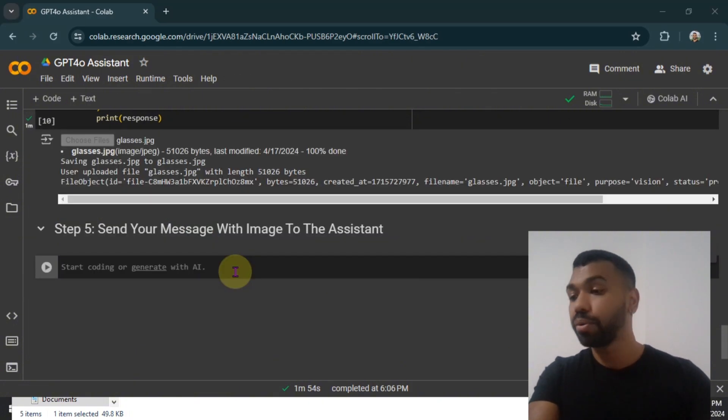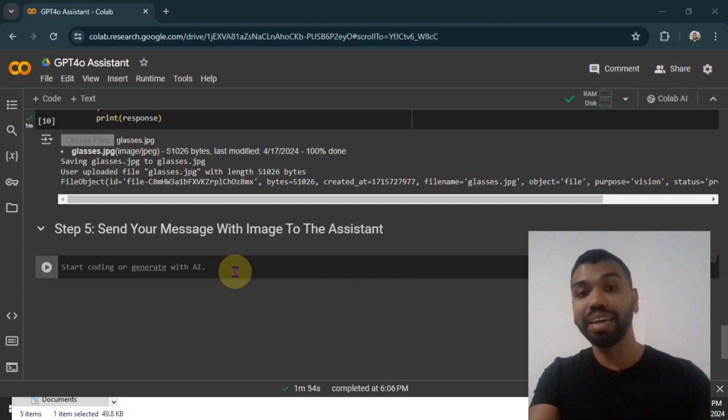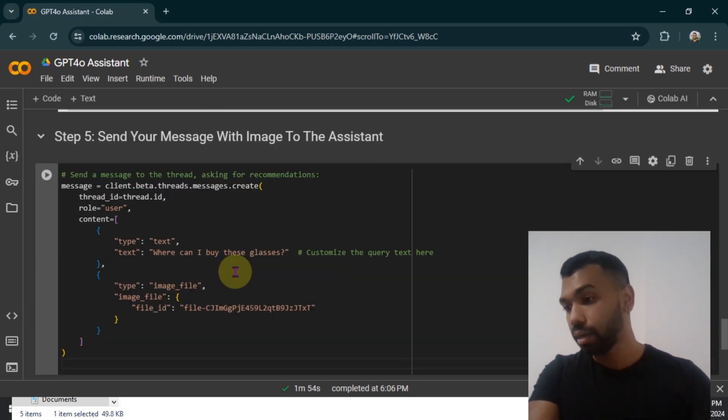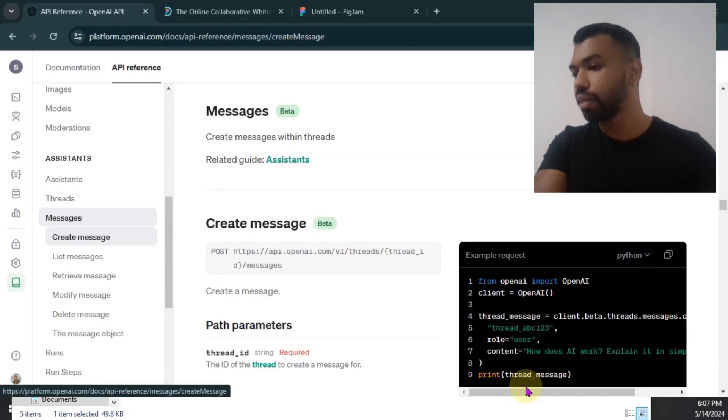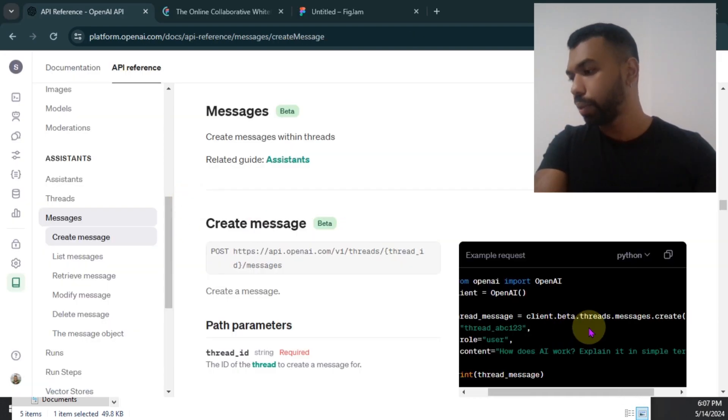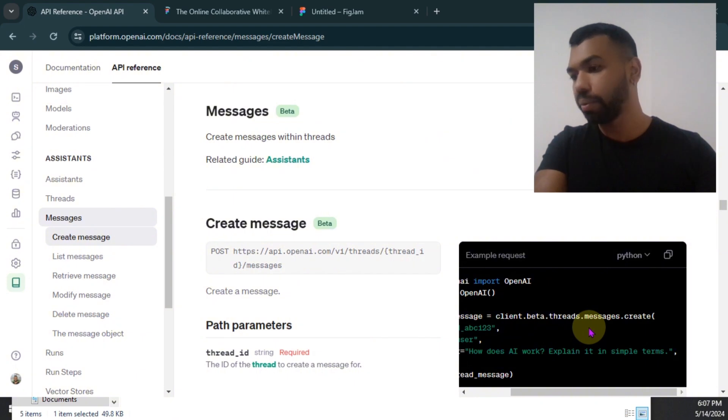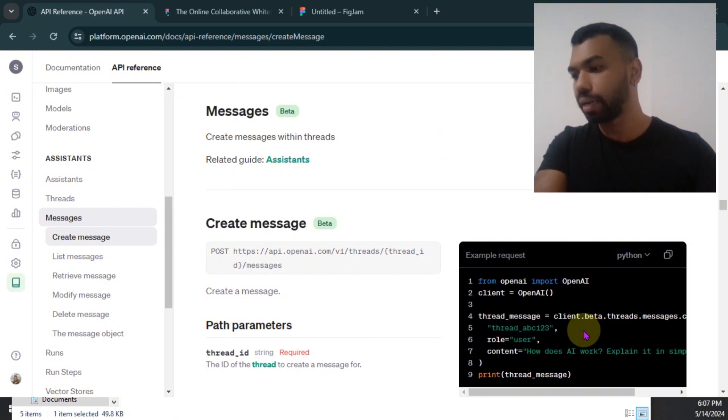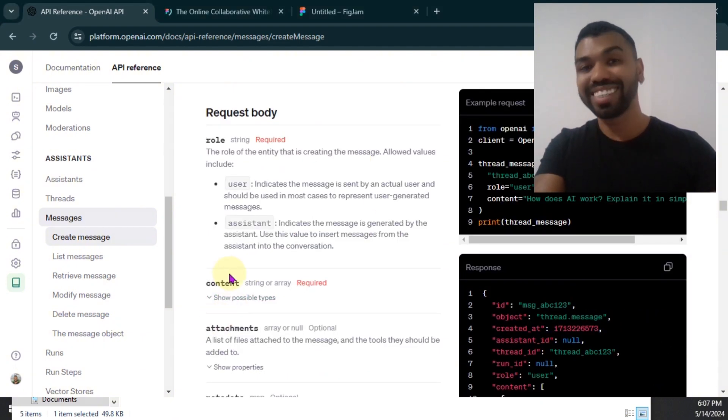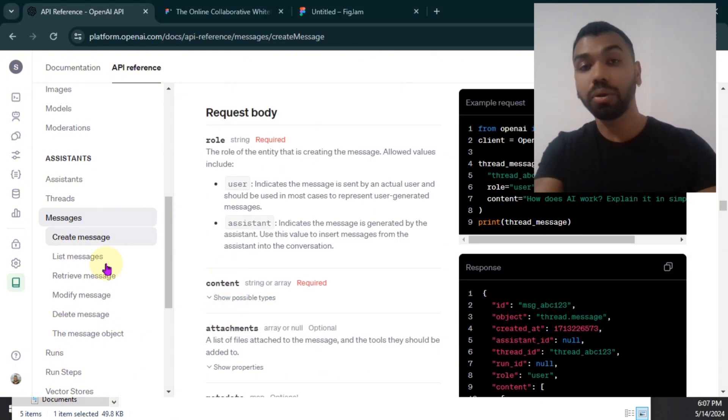Step five, we're going to send our message with the image to the assistant. So we're going to use the threads.message create function to create that message. And then under the content section, we're going to send off not just the text, but also the image.